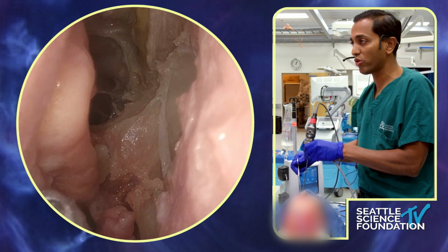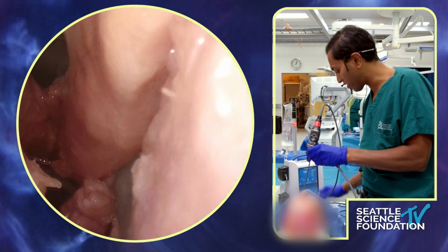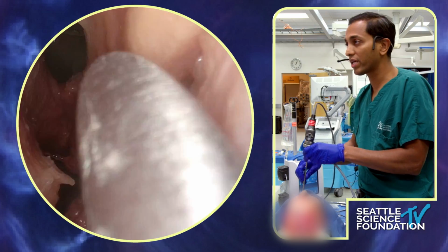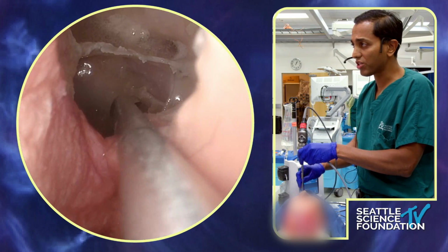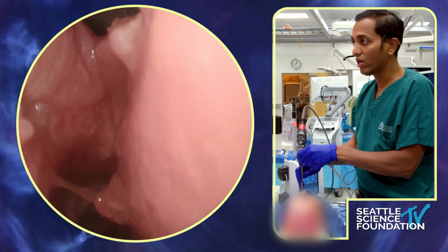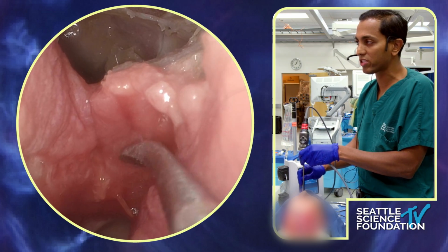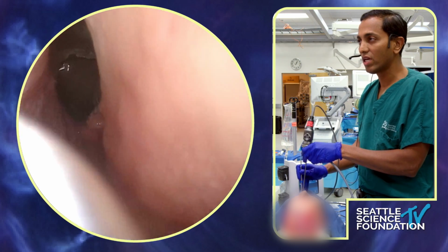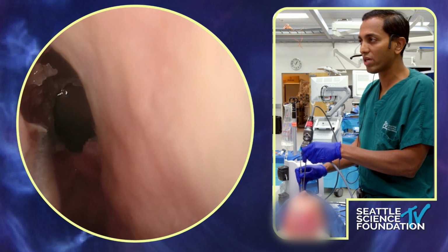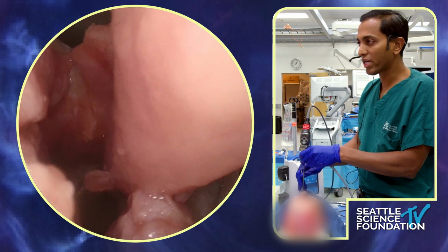The other option is if you want to raise a small little nasoseptal flap. I did also kind of mark it out a little bit here. Here's your sphenoid ostium. Here's your choana. We know that it's a posterior septal branch of the sphenopalatine artery coming through here, so any graft in this area is what you can take. And so you could elevate, make an incision up here. You can see I've kind of made this incision already. And then you would also make a posterior incision.